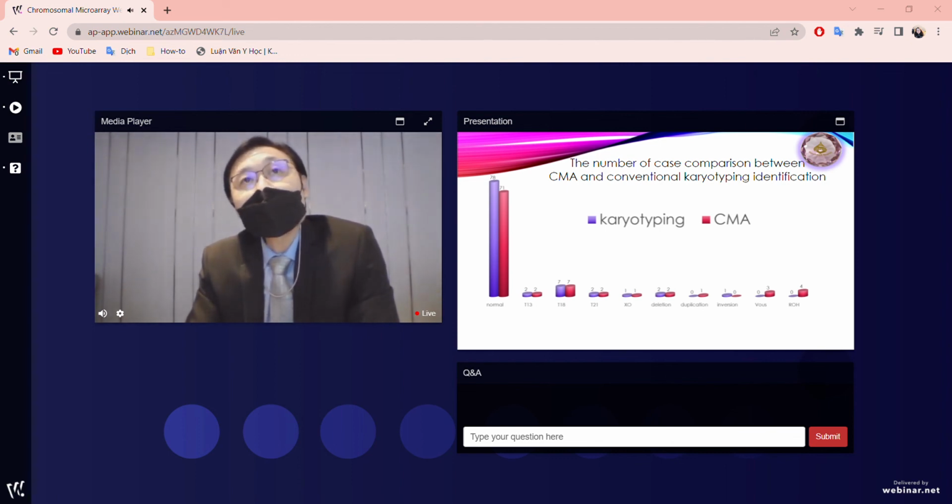And then have a look at the abnormal group. In the abnormal group, the concordant group is found in trisomy 13, 18, and 21, and also Turner syndrome and deletion. And in the discordant group, we found duplication, inversion, VOUS, and ROH.